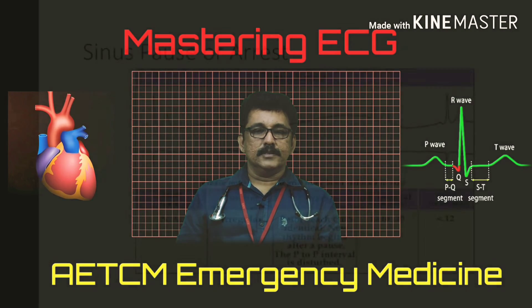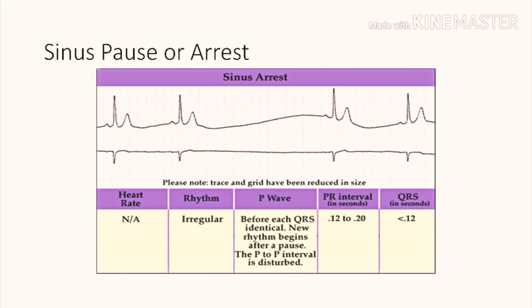In this ECG, the first and second complexes are normal. In the third and fourth positions, there is no P-wave and no QRS complex — the atria, junction, and ventricle are all not generating electrical impulses, resulting in a long pause. This is called sinus pause or sinus arrest, a dangerous condition in which the patient can develop sudden death.